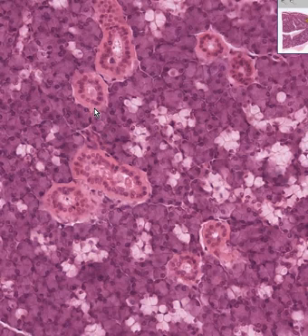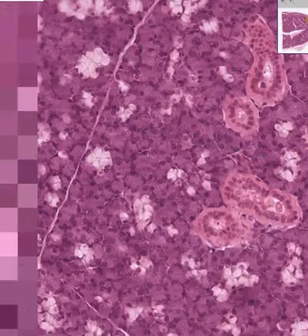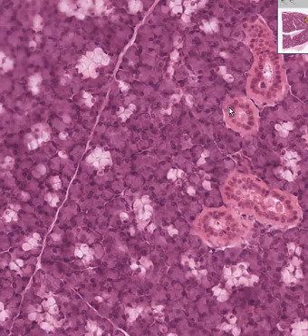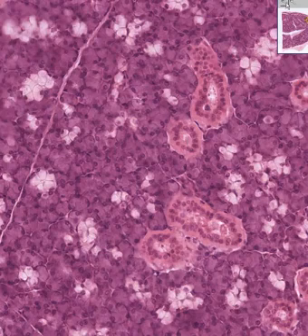Like the parotid gland, you can also see that there are a lot of intralobular ducts, which have bright red, slightly striated cytoplasm. You can see slight little lines. So these are the intralobular striated ducts. And if you looked around with a little more patience, you would see other type of intralobular duct, which does not have this bright red cytoplasm, but less of a cytoplasm, which would be, once again, an intercalated duct. Maybe we'll see one somewhere along the line.